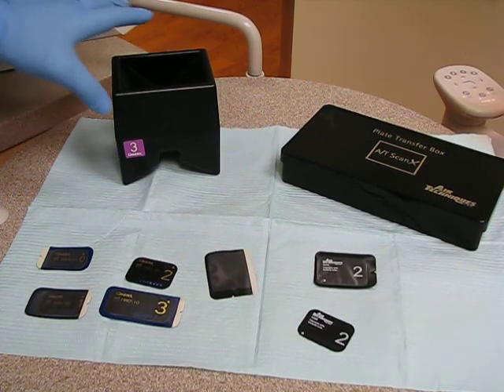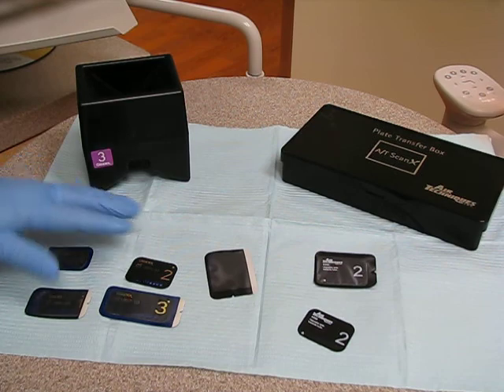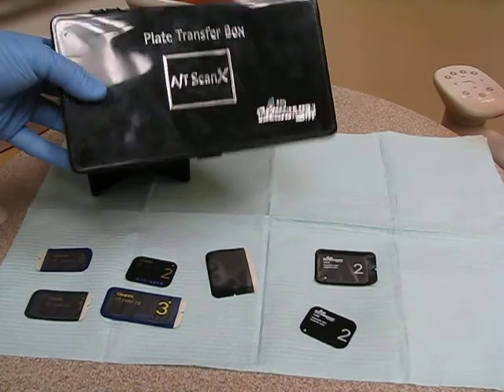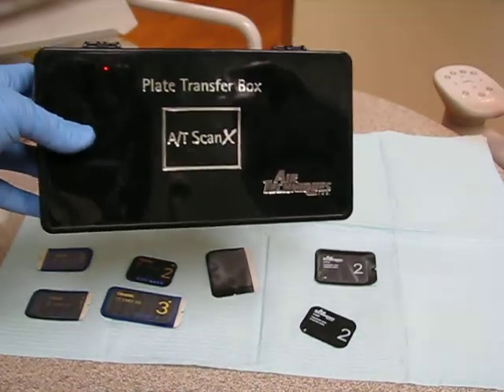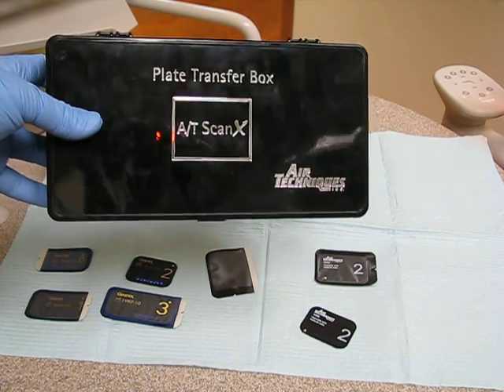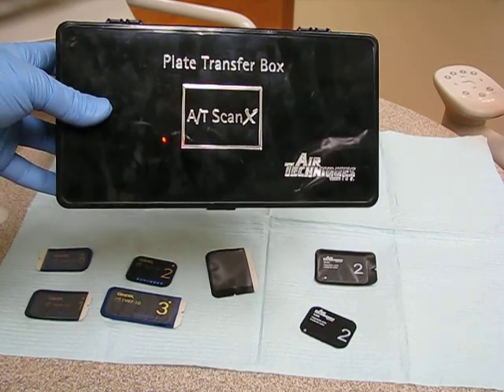These were purchased through Gendex product. This is a plate transfer box by Air Techniques, and you can see on it 'AT ScanX.'